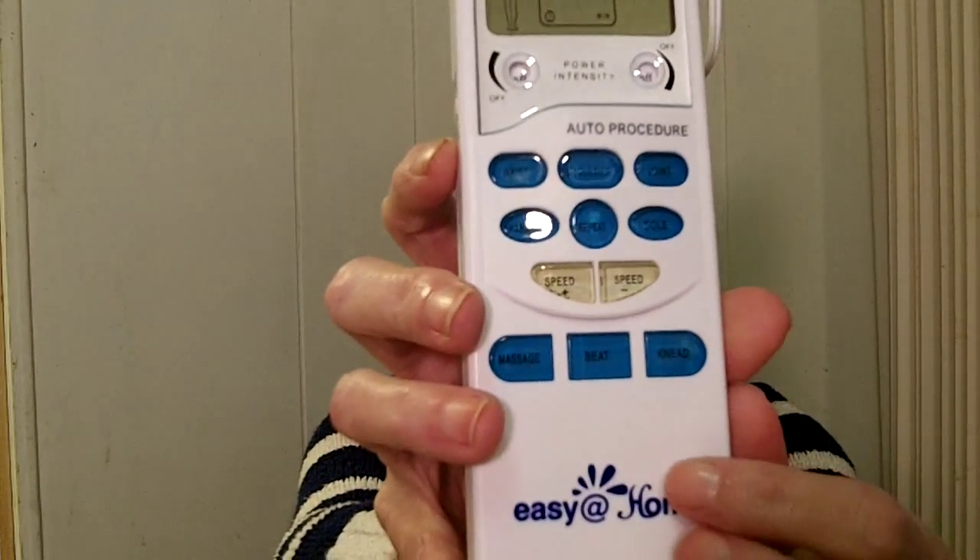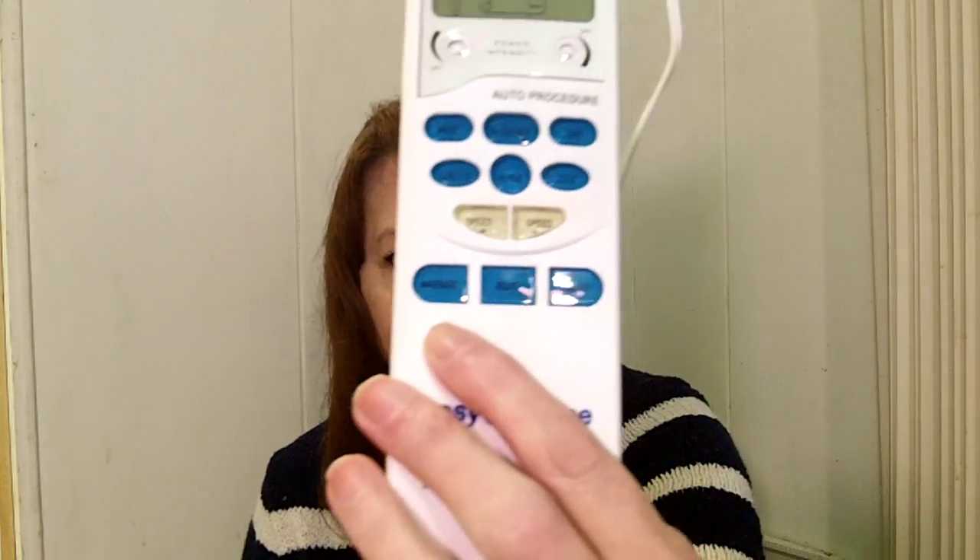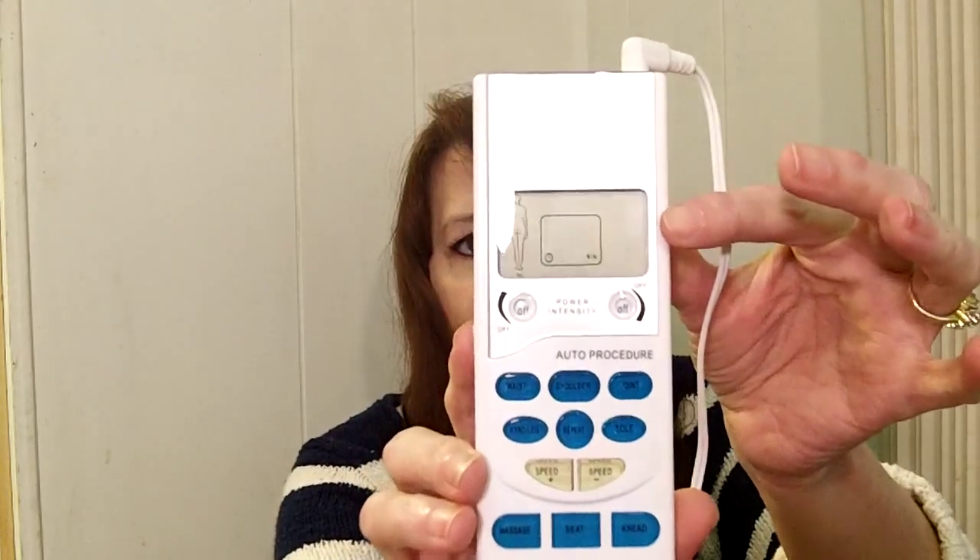There are two different channels — I'm just going to use one lead, but you can use both if you want to cover a wider or larger area. These little buttons say waist, shoulder, joint, hand and leg, and sole of the foot. There are speed settings and massage, beat, and knead modes. I was using the massage setting, and a treatment lasts 15 minutes. The screen shows whether the leads are on correctly — it gives you two thumbs up, which is kind of cute.